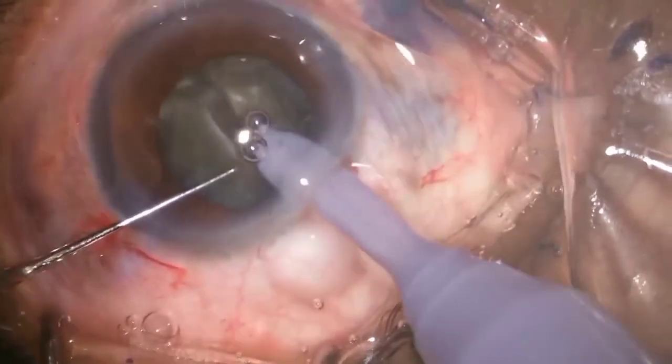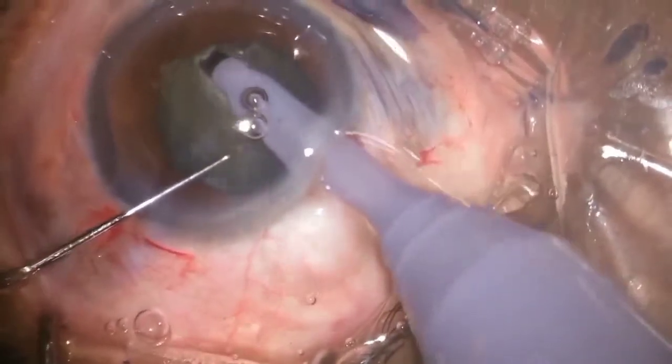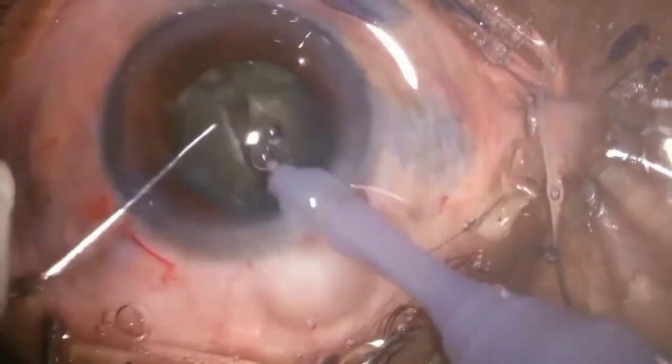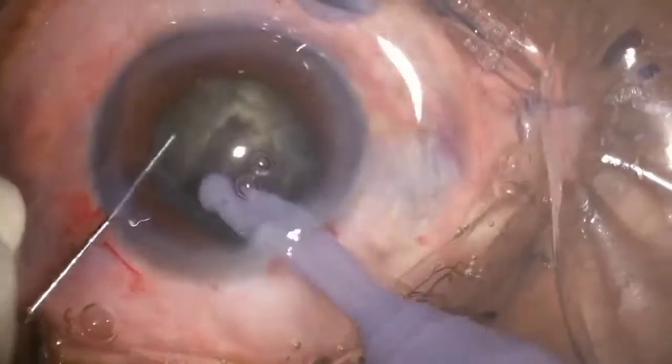Once I saw that around 20% of the trenching was done, I decided to rotate it and do the procedure of divide and conquer.